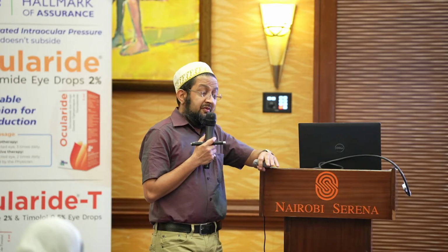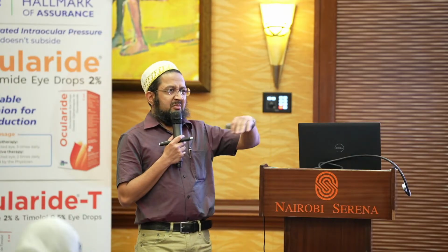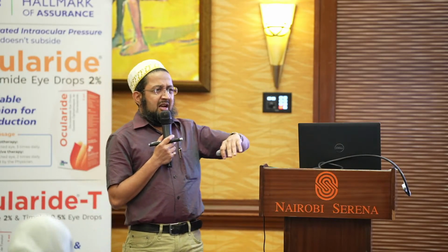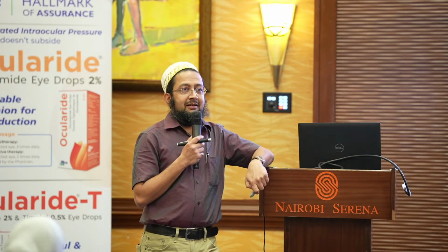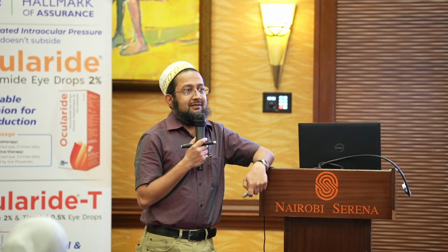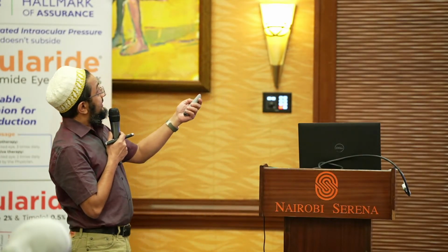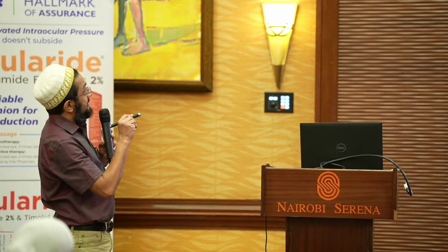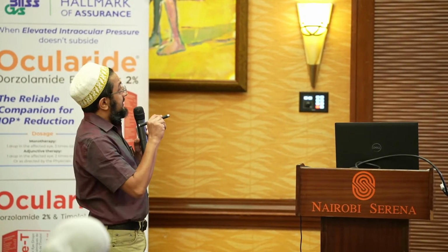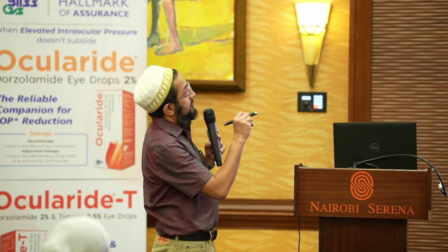And to be very honest, the first time when I looked at the patient, I almost missed it. I thought it's just a subretinal, like a band. Then when I looked again, I saw that thing moving. I was very happy actually, but the patient was not. So you can see, this is where I started doing the laser. The thing moved, came here. I started doing more laser, the thing moved. Finally, I was able to capture it here. And you can see this is the worm which I've lasered.